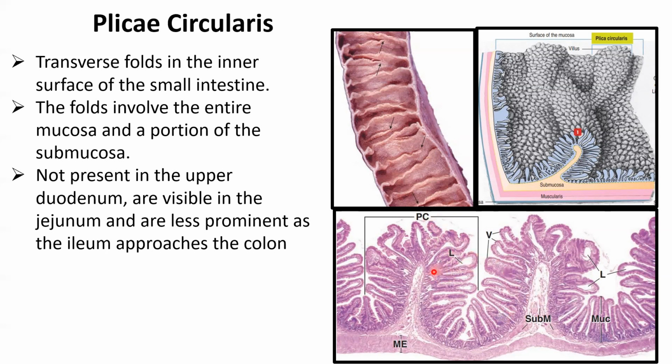Yeah, so this is the mucosa. Starting from the layer of the muscularis mucosa, thin layer here. Lamina propria is the connective tissue filling between this epithelial, and this is the epithelium here. This is the submucosa. The submucosa, part of it making the plica circularis, and the other stays spread here. And this is the muscularis or muscularis externa. Those PCSV and stuff, I usually explain that in the notes in the slide, so you can know that too.